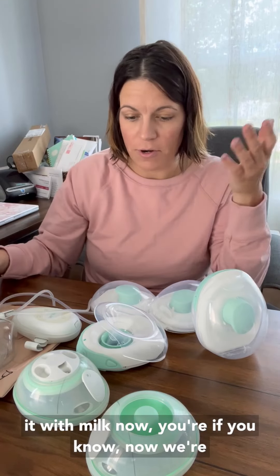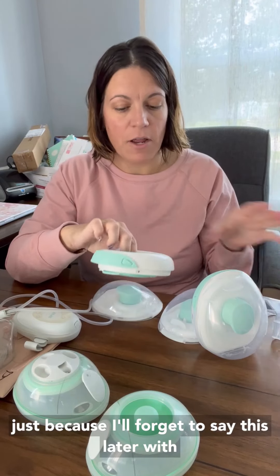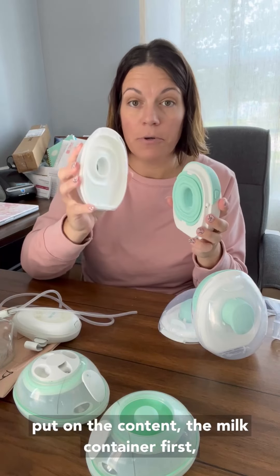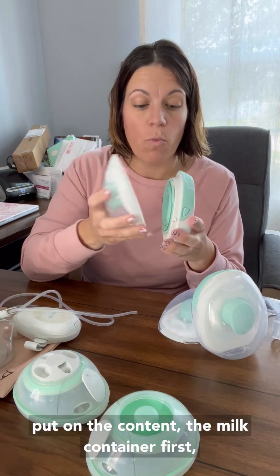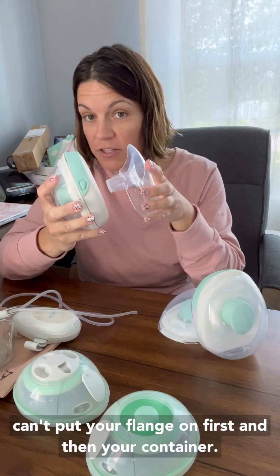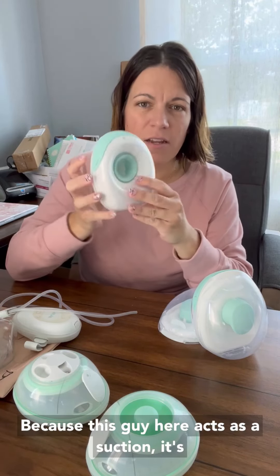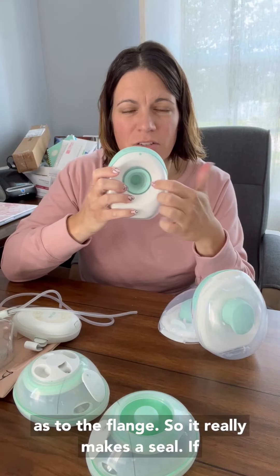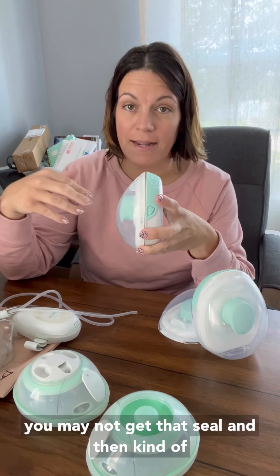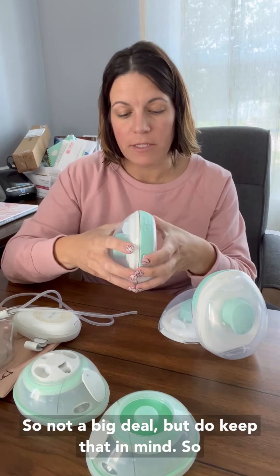And then when you fill it with milk, now we're talking volume. I want to touch on this quickly because I'll forget to say it later. With the Willow Go, when you assemble this — this is your diaphragm for your suction — you have got to put on the milk container first and then the flange afterwards. You can't put your flange on first and then your container, because the diaphragm acts as a suction and creates a seal with the flange. If you put the flange on first and then the container second, you may not get that seal and you'll have to break it and redo it. Not a big deal, but do keep that in mind.